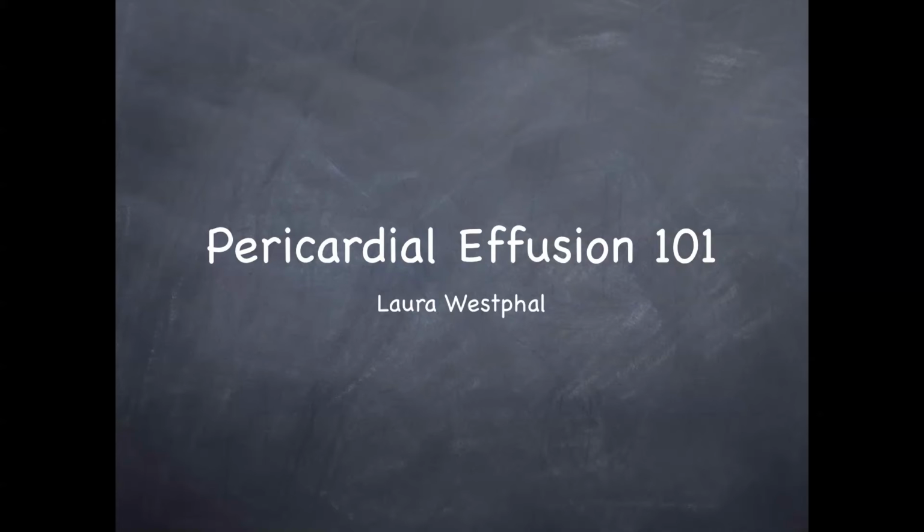Hey guys, Jackie and I thought it would be helpful to review some of the basics of ultrasound. We're going to start with pericardial effusion.